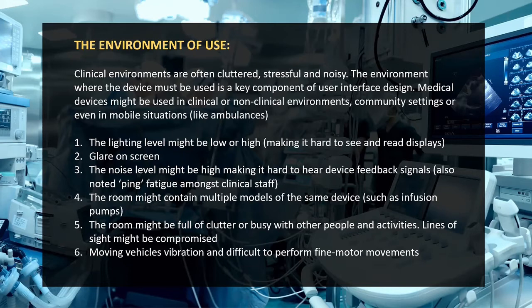The room is often full of clutter, but it's also often filled with other people and activities happening. So you've got to make sure that lines of sight and the device positioning are correct. This device could be in a moving vehicle like an ambulance, so you have to deal with vibration, and then you find that it's difficult to perform fine motor movements as part of that environment.